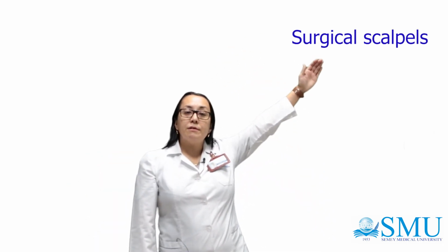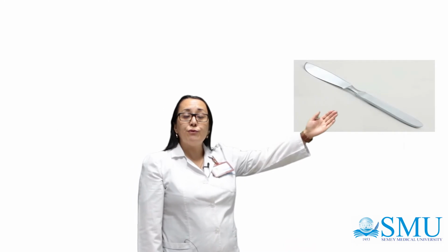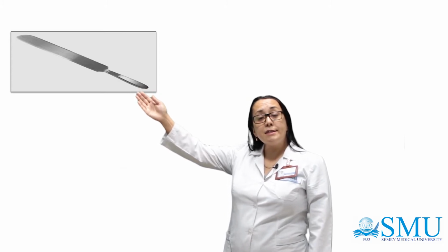Surgical scalpels. Surgical scalpels are divided into amputation knife, used for amputation of the limbs, cartilage knife, used for cutting costal cartilages and dense tissues, anatomical brain knife, used for brain dissection and autopsies.